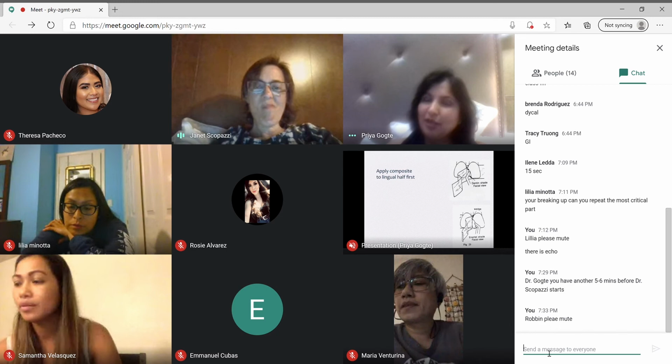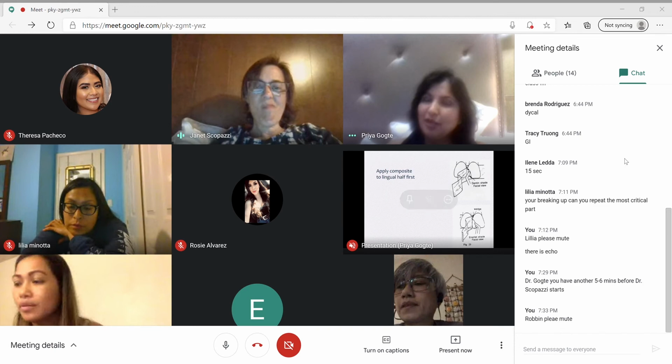I'm sorry, I didn't hear the question. There was a background. It's about composite is cured in what increments? Like, do you cure it for 10 seconds, 20 seconds, 30 seconds? Or it depends upon the light, the composite light? It depends on the light.